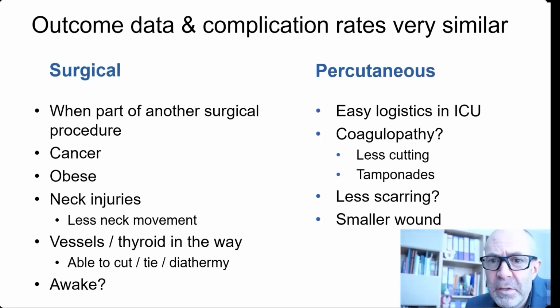And finally, if the tracheostomy needs to be done under local anaesthetic with the patient awake, typically we do that with a surgical approach. It is possible to do percutaneous awake tracheostomies, but I think a surgical approach is more established. One of the big advantages of a PDT in the ICU is the logistics.